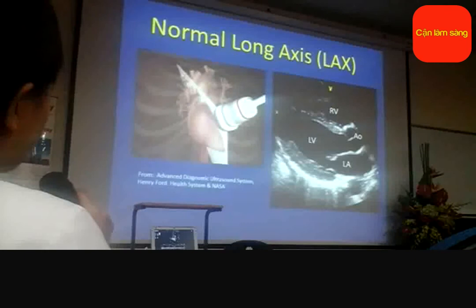And this is the anatomy that we see in the parasternal long axis view.